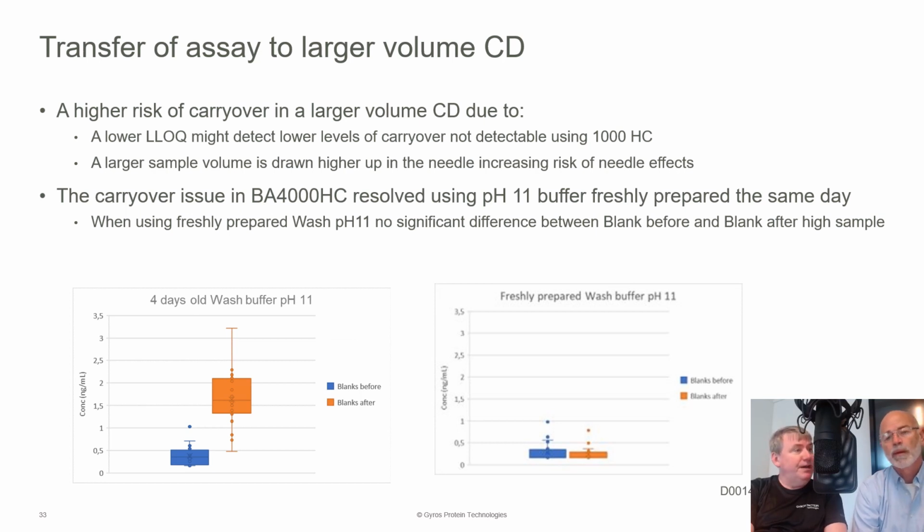Sticky molecules. With pH 11, we recommend up to a week of storage, but there is definitely a reduction in its effectiveness sometimes for some analytes. So again, 99% of the time it's fine to prepare weekly, but on the odd occasion it does warrant fresh preparation. So it's something to investigate when you set up an assay, whether fresh pH 11 will actually improve things.